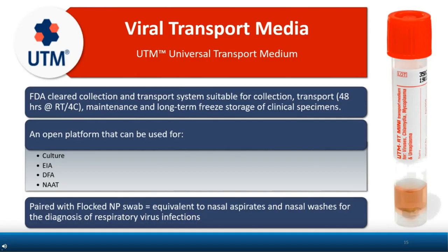So that was talking about the swabs, and as I said, they're not all created equal, and now you understand why. There's also a variety of different transport media that have come into use during the COVID pandemic. And first is viral transport media. This is an example of UTM, which stands for Universal Transport Media. It is an FDA-cleared collection and transport system that's suitable for the collection and transport of specimens to the laboratory, either at room temperature or at refrigerator temperatures. And you can also maintain these in long-term freezer storage for weeks to months as well for your clinical specimens.